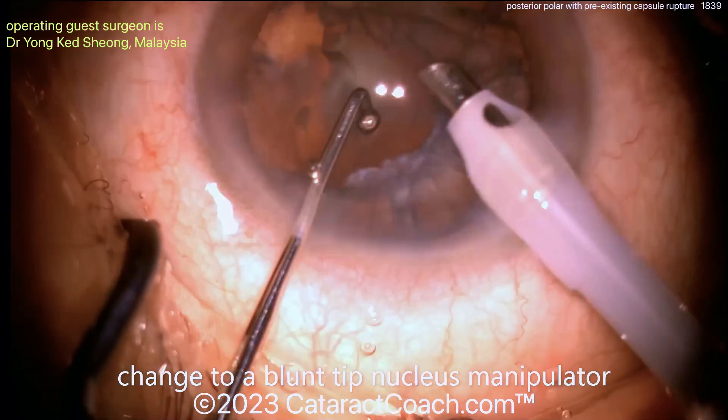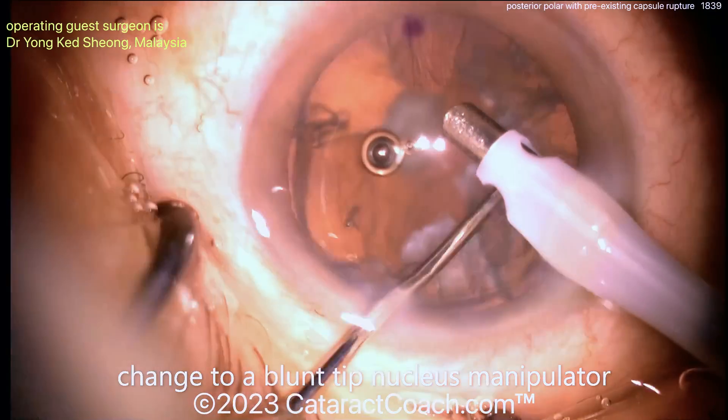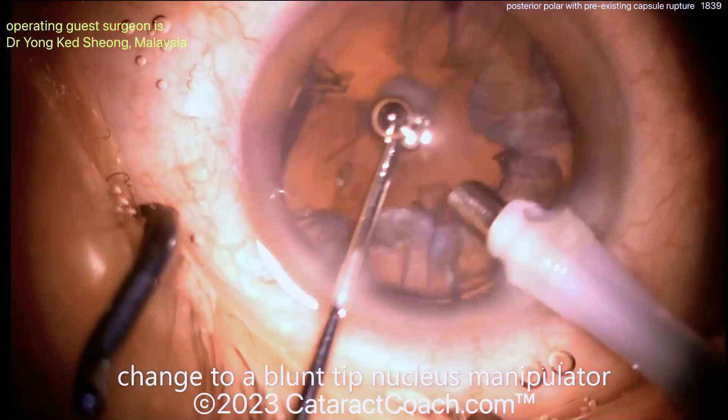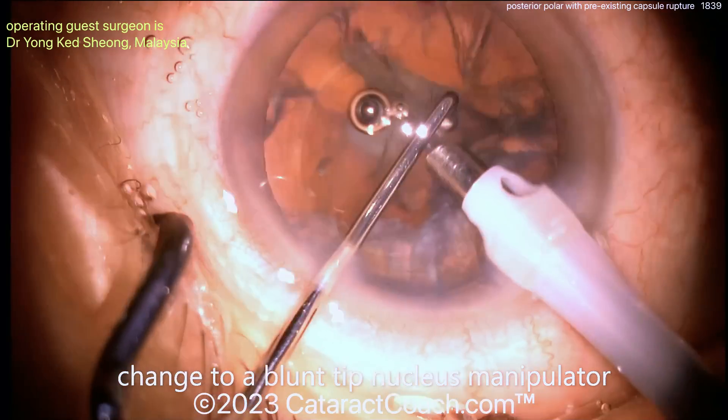For the cortex, you're going to be very gentle here. Almost certainly the best option is going to be putting in a sulcus lens — a three-piece lens — with the haptics in the sulcus. The optic can be captured via buttonhole through the anterior capsular rhexis.